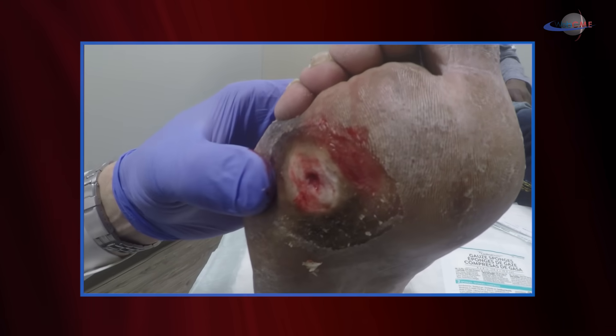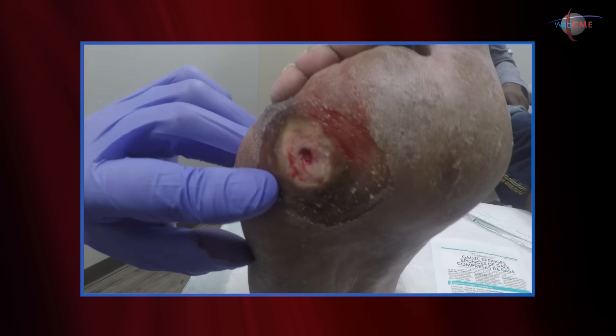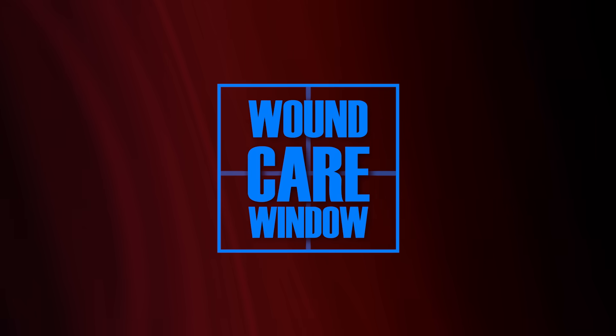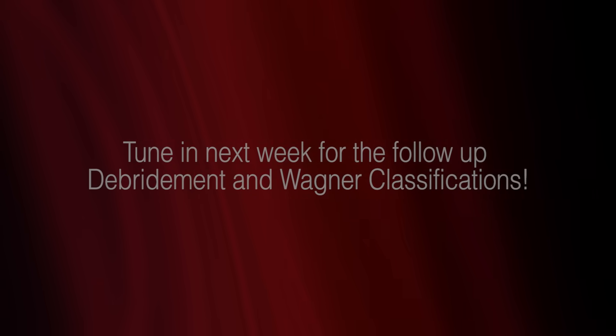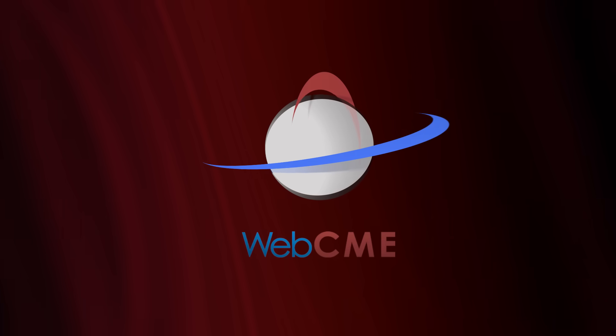So this is an adequate debridement of a patient who presented with a diabetic foot ulcer. This is the first step in managing this patient.